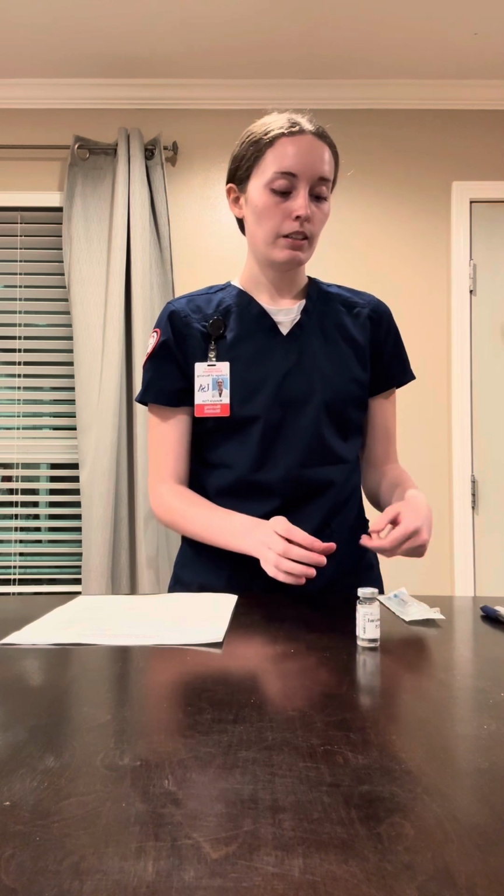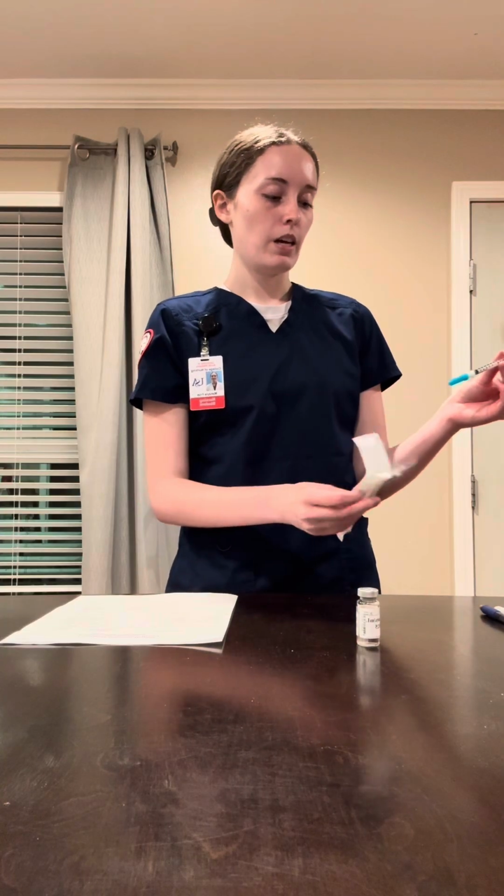All right, so now I'm going to open up my syringe. Pull this out, set that to the side. So I'm going to uncap this, and now I'm going to draw up 0.5 milliliters of air, not touching the inside because I don't want to make it unsterile.